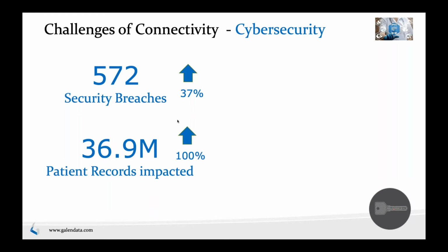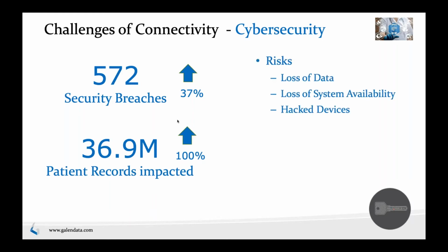So lots of potential exposure. The top risks are generally loss of data, which we'll talk about in terms of what additional risks they bring; loss of system availability, so your devices or your systems can be offline, which may affect patients' health; and then hacked devices, so you may lose control of your devices and they'll be doing things you don't want it to do.